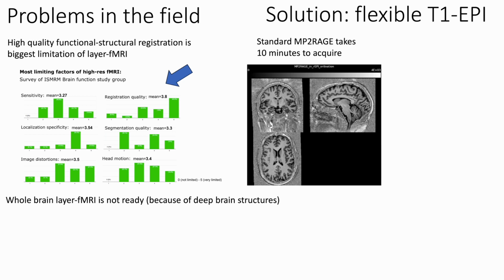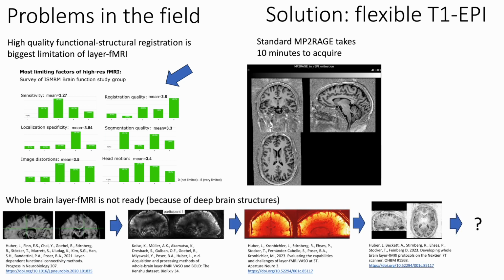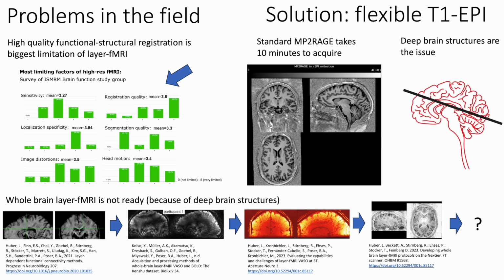And maybe the most personal motivation why I want to work on anything whole brain 3D EPI is because for like 4 or 5 years, I've been investing a lot of effort to get whole brain EPI working, with mixed success. Like, I think we were successful in the sense that we could convince the field that there is signal to harvest. We don't really know how stable it is. There is a lot of potential, we convinced people of that, but still it's hard, specifically if you look at the bottom 60% of the brain, which is usually not looked at in layer-dependent fMRI.